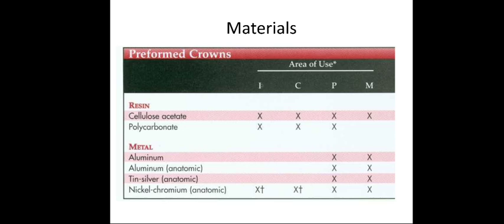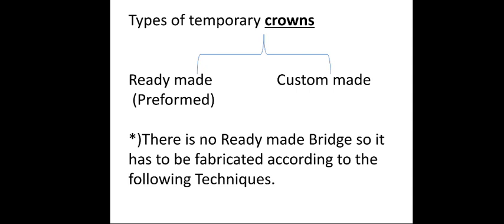The materials used for temporary crowns. The temporary crowns may be direct or indirect.